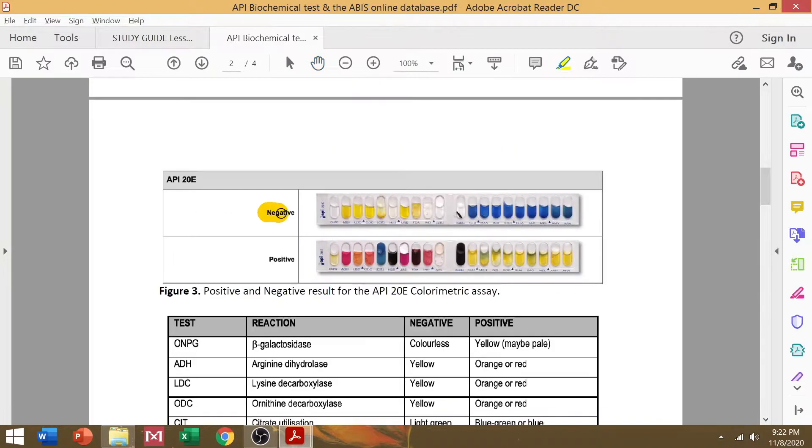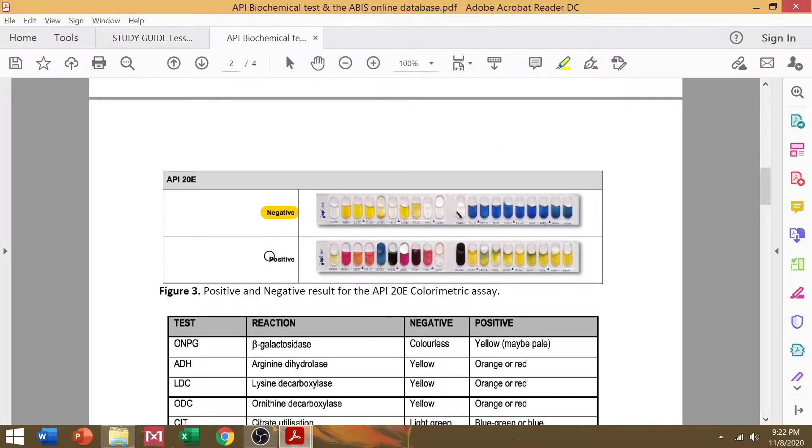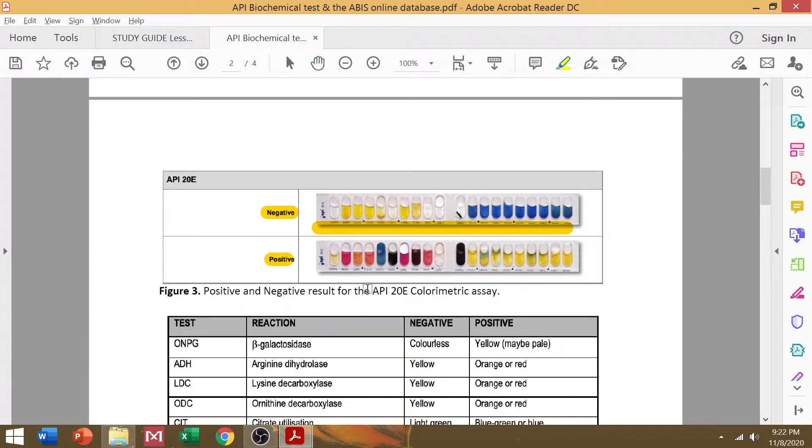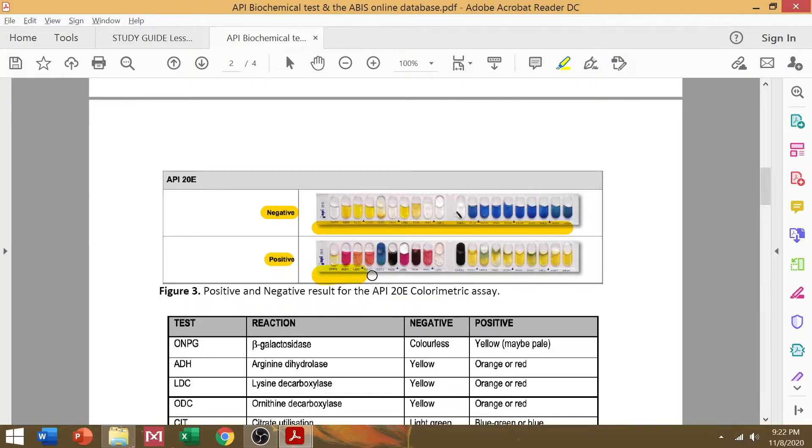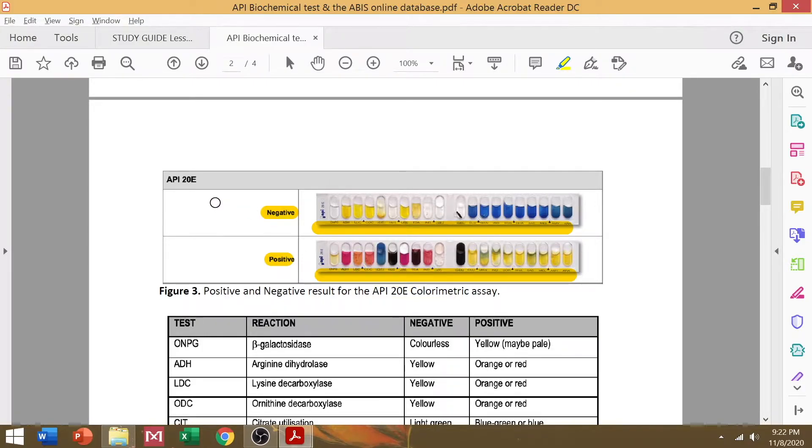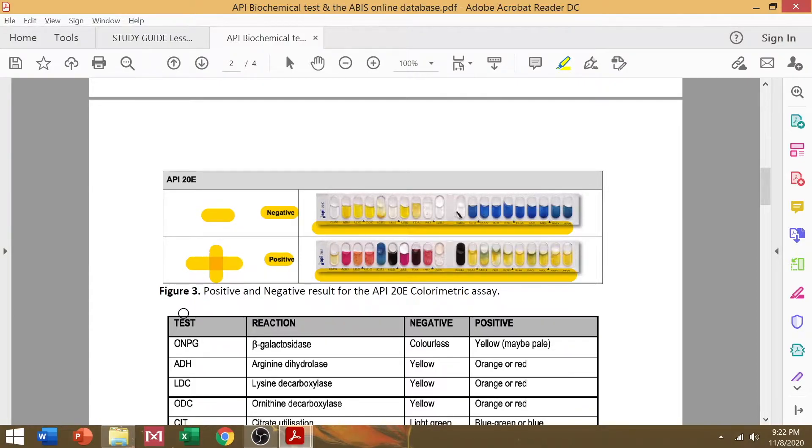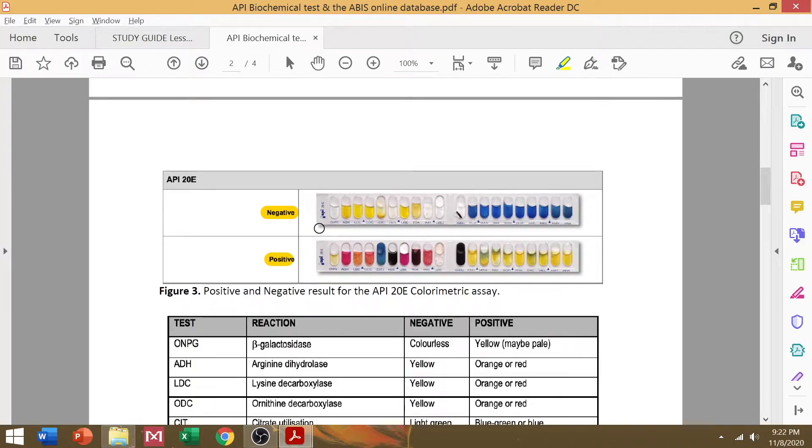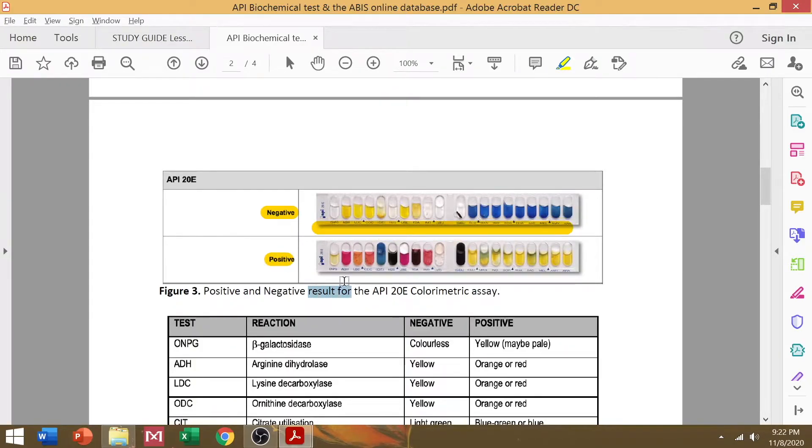In particular, we're using what we call API 20E, which is a biochemical panel for identification of and differentiation of the members of the family Enterobacteriaceae, your Enterobacter family. So, the most important thing to focus on here is the color changes that can happen with your isolate.